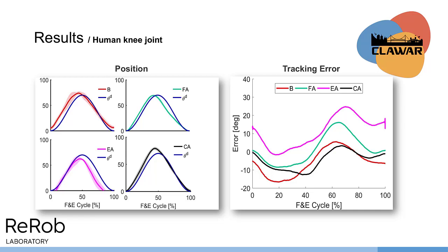During BEAR mode, we observe that in the extension phase, the movement deviates from the reference trajectory. This is because the subject started with a partially flexing knee, leading to higher velocity during this phase. However, during the flexion phase, the knee's angular velocity was lower, resulting in the movement ending in a semi-flexing position.